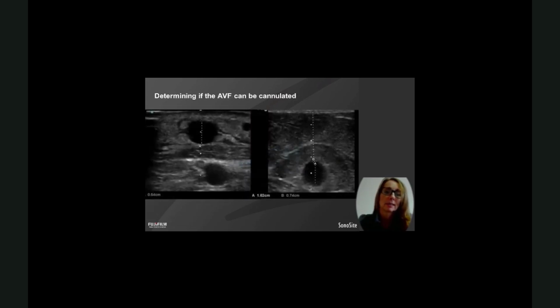This helps, as I'm certainly noticing more and more obese patients coming on dialysis. They have fistulas created and they come to us and we're told that we should be able to cannulate them. It's very difficult to palpate, but we don't know how deep. We just know it probably is deep, but we don't know how deep. So we cannulate. If we don't have ultrasound, we would cannulate in the hope that we'll be able to reach it. If we had the ultrasound, we could put that on and measure the depth and say from the beginning, it's actually too deep, you need to superficialise it.